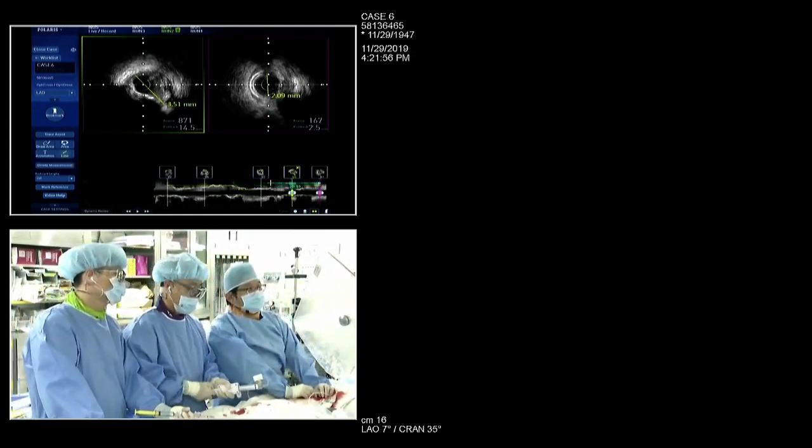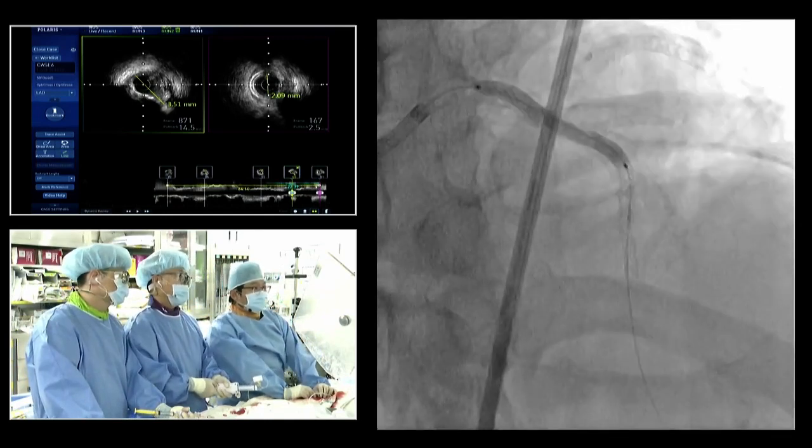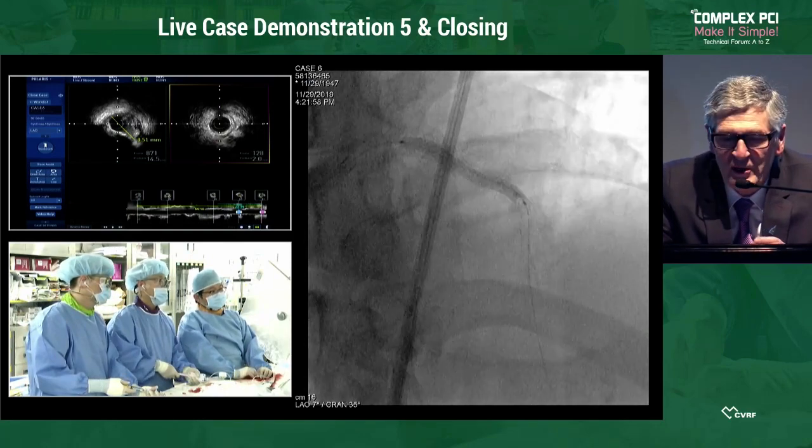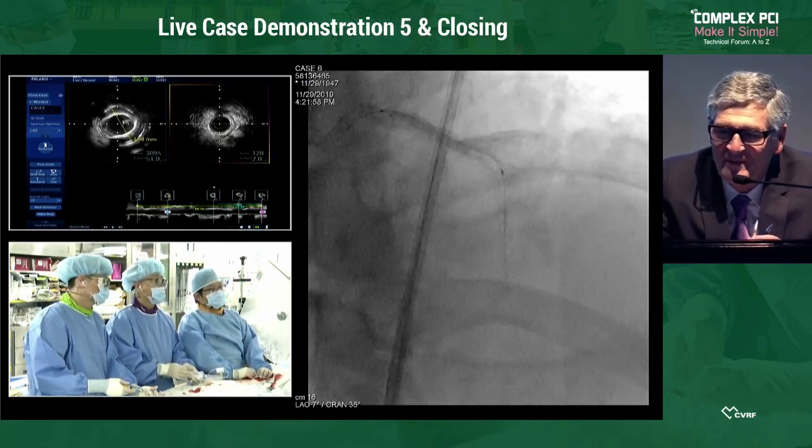Okay. So now, if you use a 3.0 balloon to post-dilate a little bit more distal, terrible. Deflate. There is a risk of closing the small diagonal. Yes.